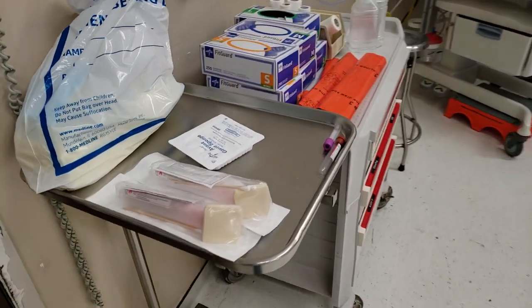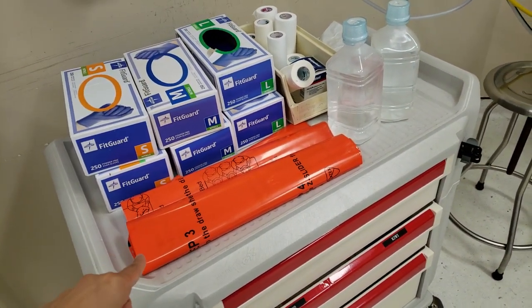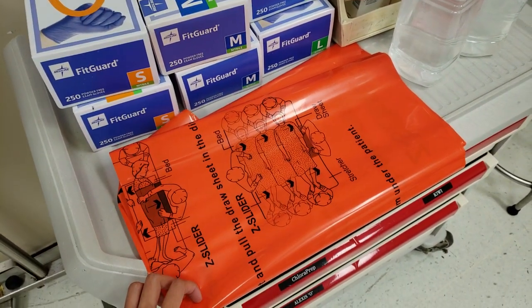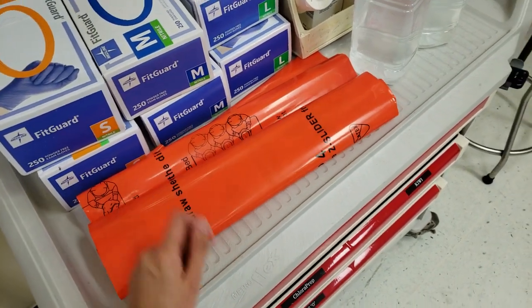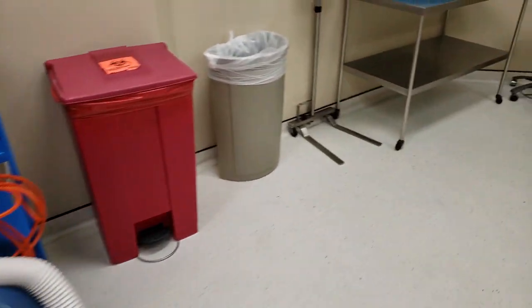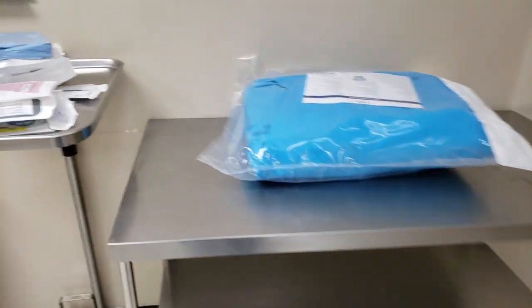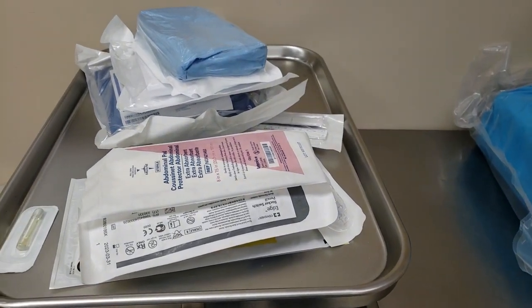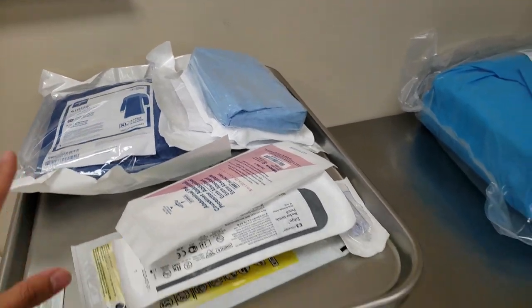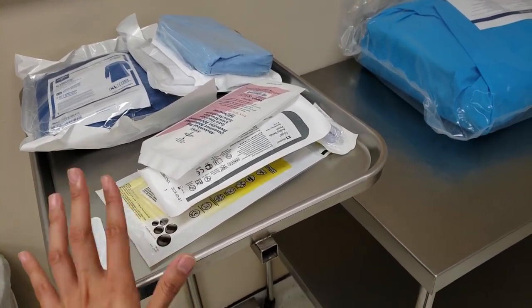So this is all the stuff that I prepared for the nurse. This actually goes underneath the patient when we move them. It's like a little sliding thingy. It shows you on the picture. You throw that away when you're done. Then you have your Bovie, your warmer. And the supplies are already pre-picked because everybody uses the same thing except for gowns, gloves, and suture.